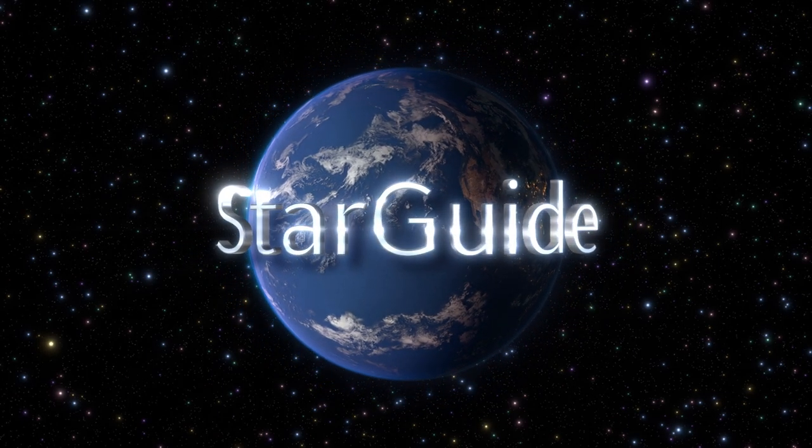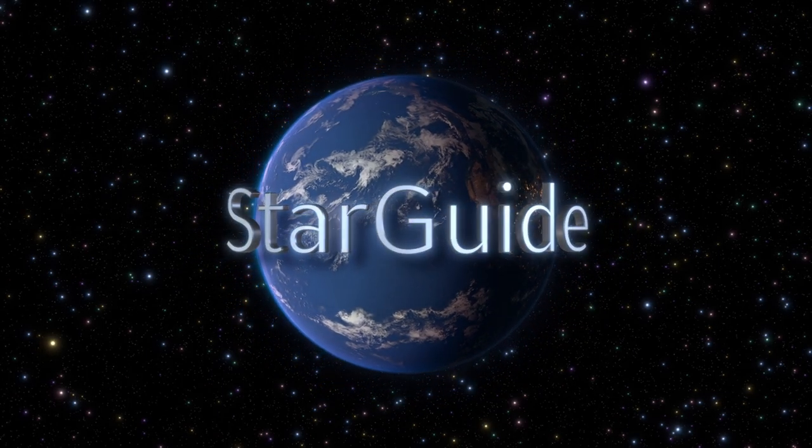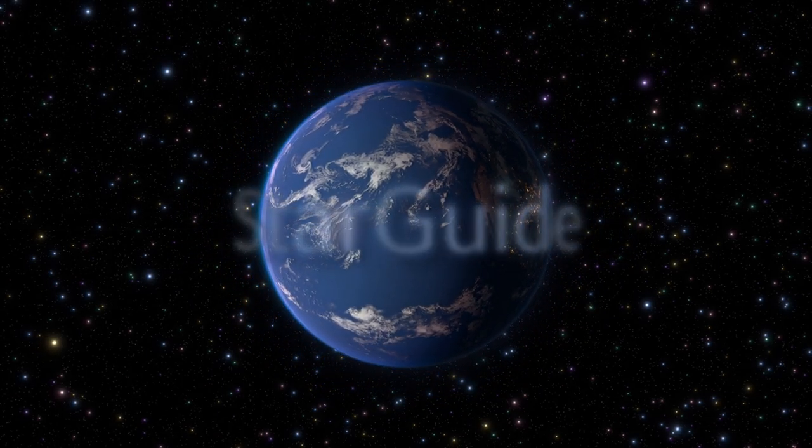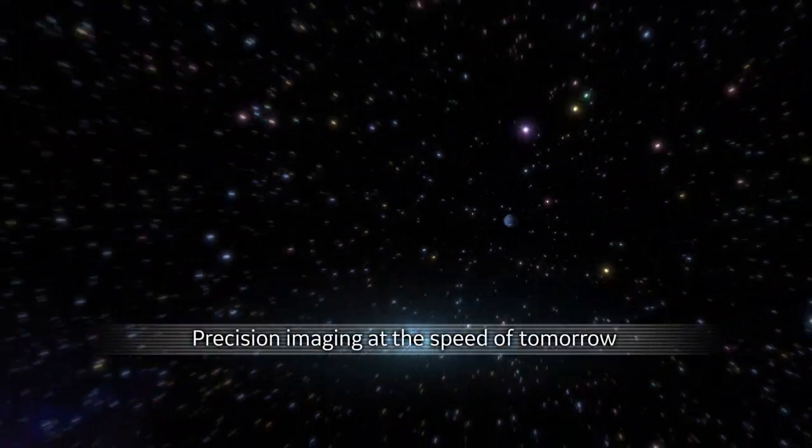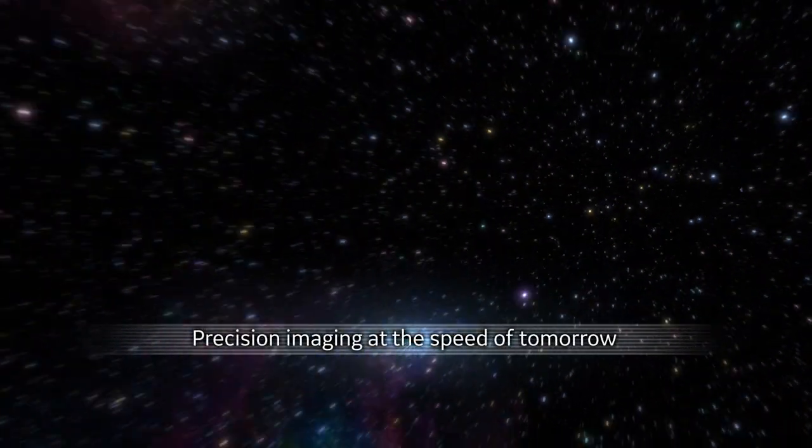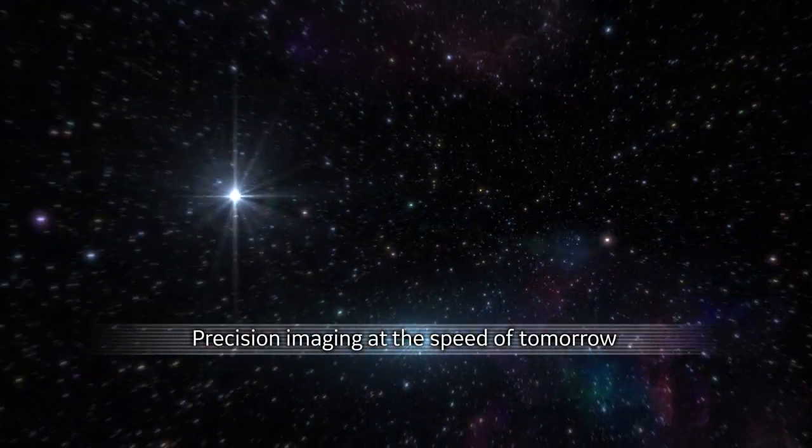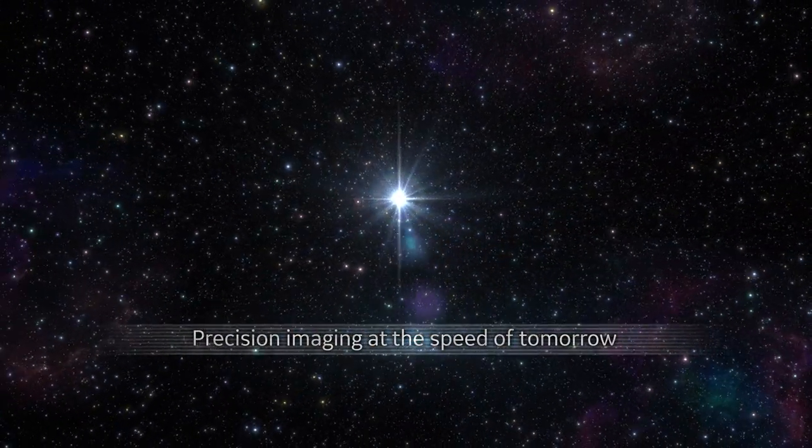StarGuide. Precision imaging at the speed of tomorrow.